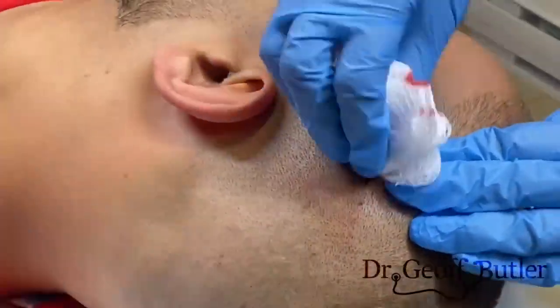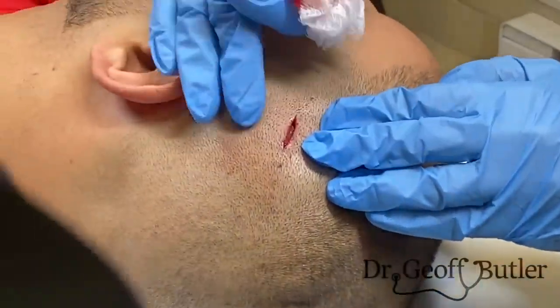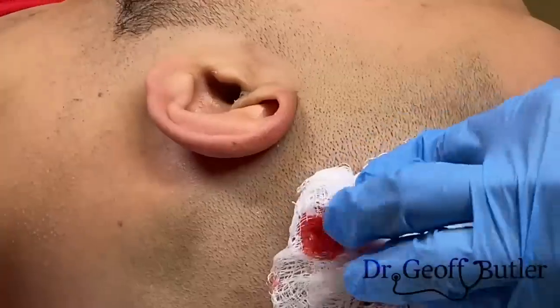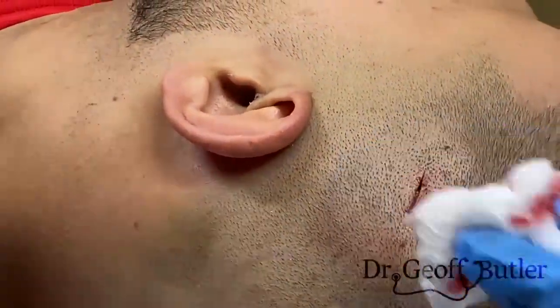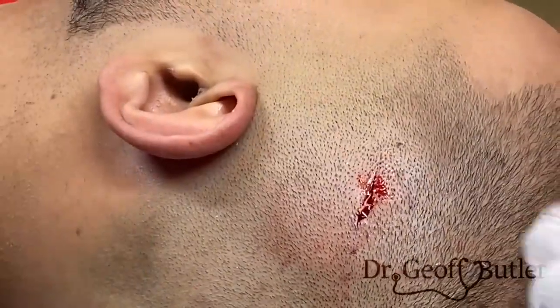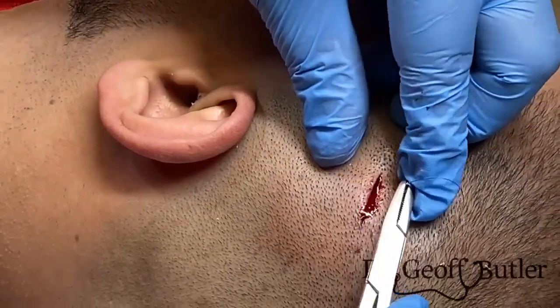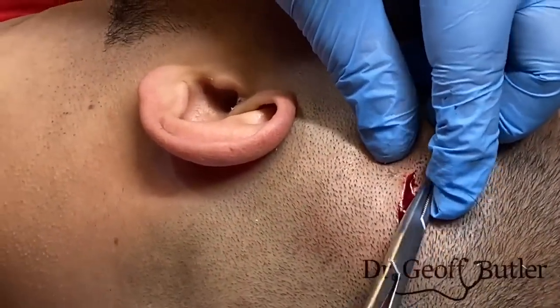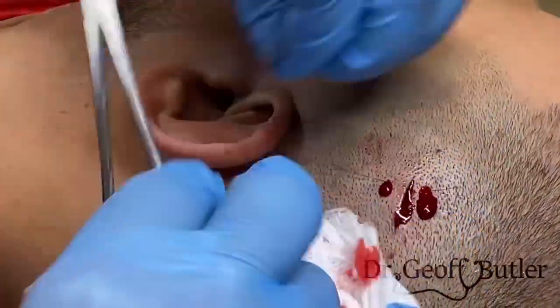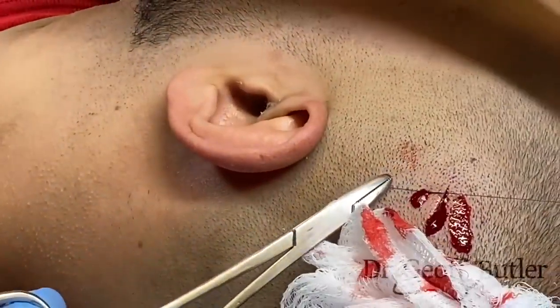So just going to grab some suture material so I'm in your view. I'll give it to you. So this is our 4-0 Prolene. Just add that for me. And you're comfortable? Mm-hmm. Just add it for me.